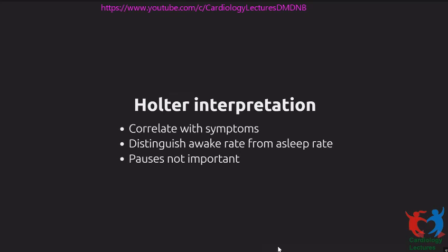The second point, as I was telling you, is don't blindly look only at the minimum heart rate on Holter. You can go by the patient diary, ask the patient when they slept, or even if you look at the heart rate profile, you can usually identify when the patient is asleep and when the patient is awake. So usually report the minimum awake heart rate and average awake heart rate separately from the sleep rates. Sleep rates have very little importance. I would say they do not have any importance.